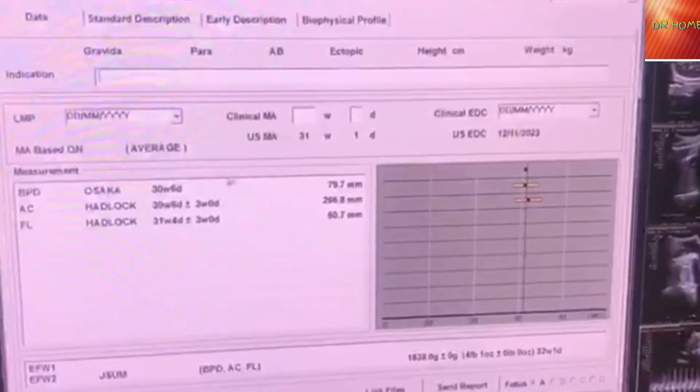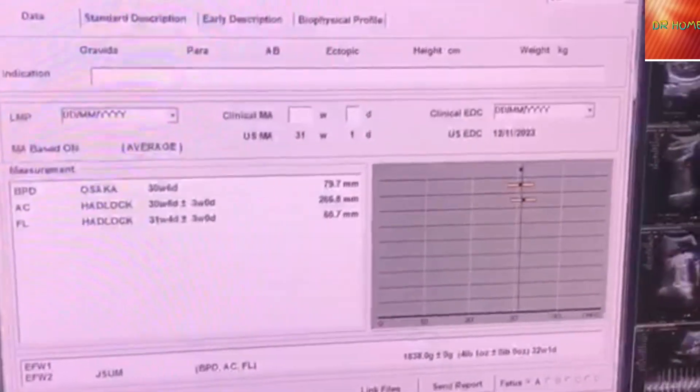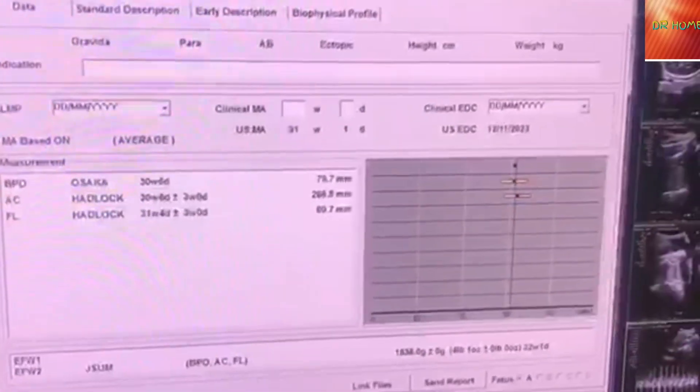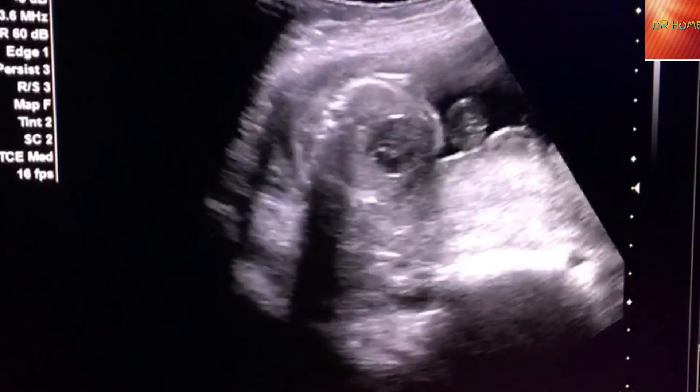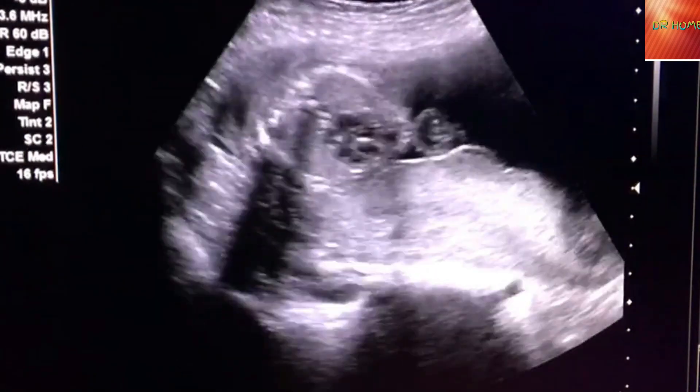This is how we take the growth of the child. You can see that for the child's growth we have taken the head circumference, which is called HC or head circumference, and the child's tummy measurement, which is called abdominal circumference.